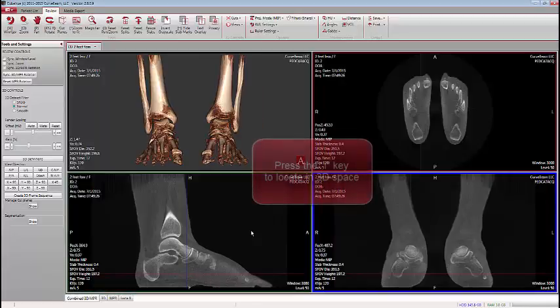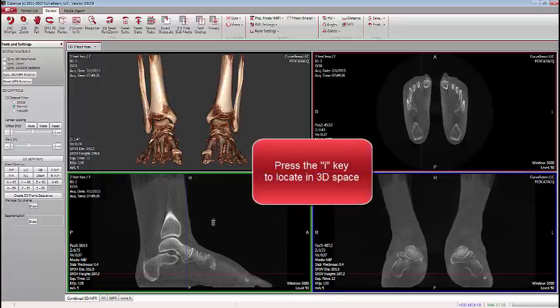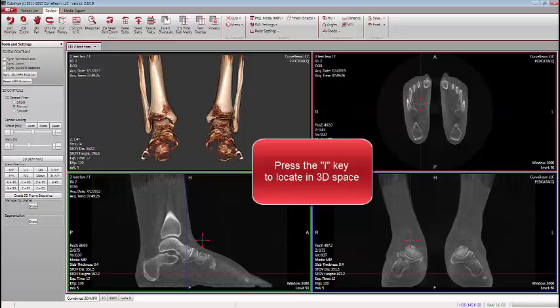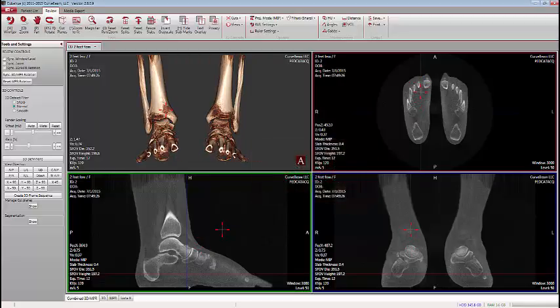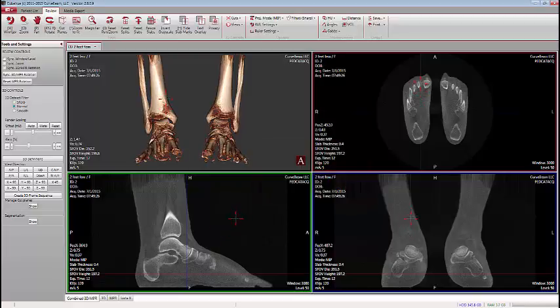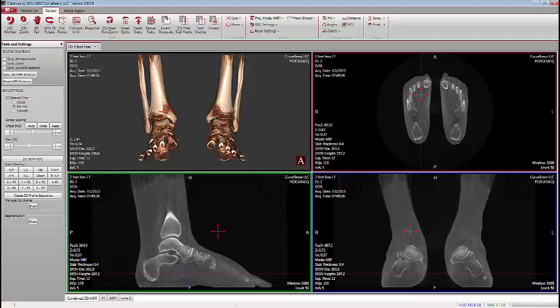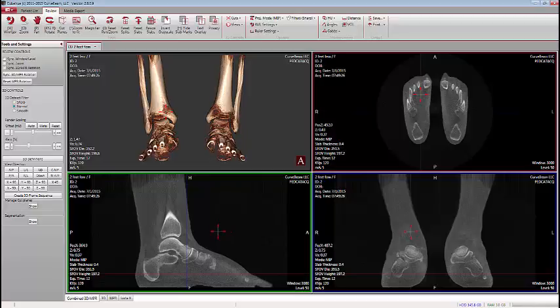By pressing the I key and then left-clicking on any image, we can see where we are in 3D space by looking for the corresponding cursor marks on the other two images. We can also see that the 3D rendering is cutting away, showing the projection of the red cursor marks on the volume indicating where we are in 3D space.